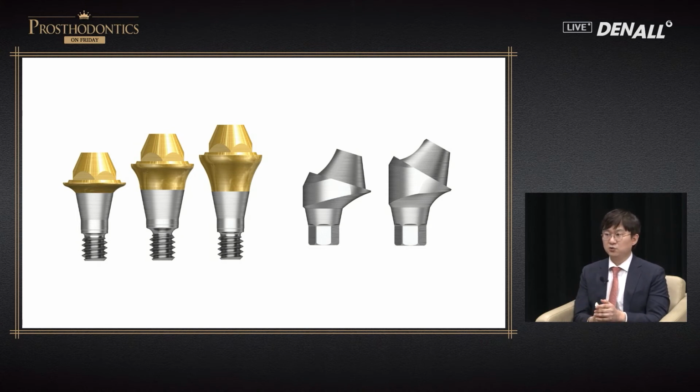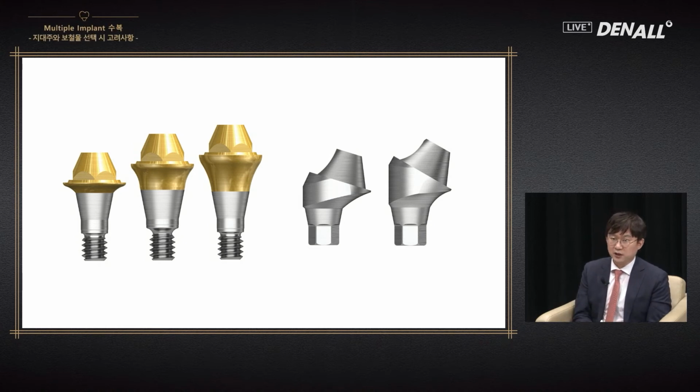Implant position should be 3 millimeters from the gingiva, so that I can choose this type of abutment. Whatever abutment we may choose, we need to consider that factor. With the angled multi-unit abutments in the mandible, we can avoid the mental foramen, and implants can be placed a little bit distally to use the screw-type prosthesis, and the direction can be changed using this.